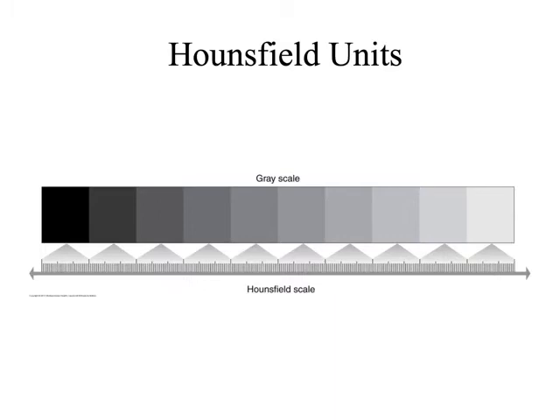So just as a comparison, compare and contrast, we've got a grayscale here, right? And the grayscale is significant because in this case, down here, it represents 2,000 Hounsfield units, but they're represented in an interesting way. They've got a 0 in the middle, a negative 1,000 out here on our left, and a positive 1,000 out here on our right. Okay? So if I were going to think through this together, I've said that the grayscale for the computer's thinking is that there's 2,000 Hounsfield units, right?